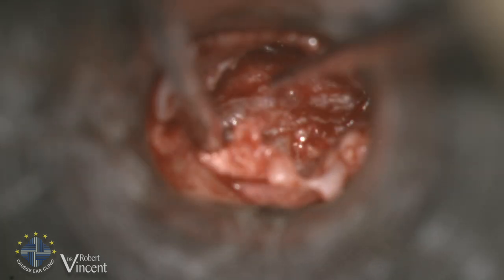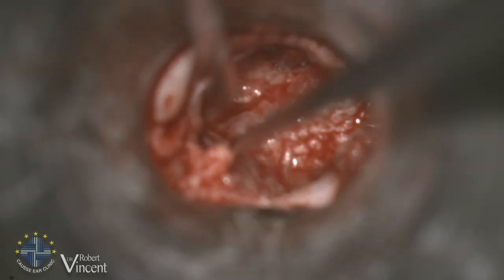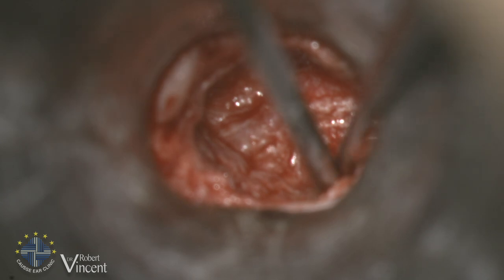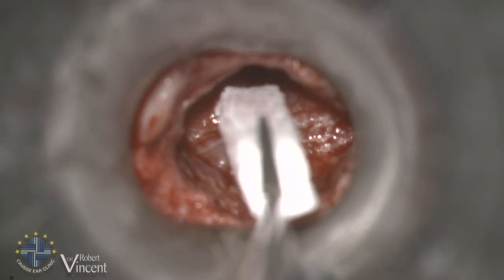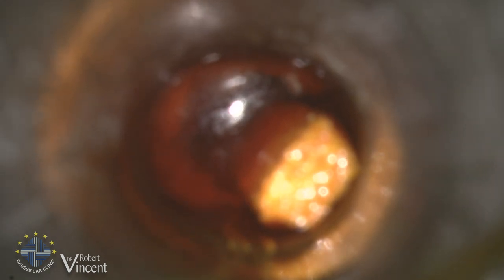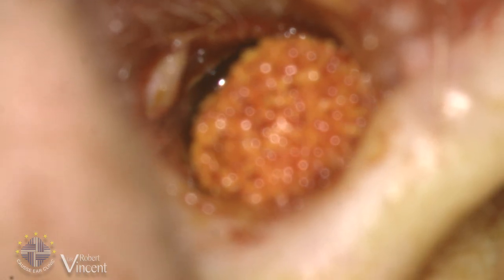Now I'll put the tympanomeatal flap back and wait six months. Then I will do again a transcanal approach, re-elevating the whole flap including the cartilage, and I will place a TORP from malleus handle to footplate. I will need to check the mobility of the footplate — I understand there was some kind of interposition, so I need to check the footplate by removing fibrous tissue covering the oval window and the footplate. If there is a fixed footplate, I will do a stapedotomy. Thanks very much for watching — see you again soon.